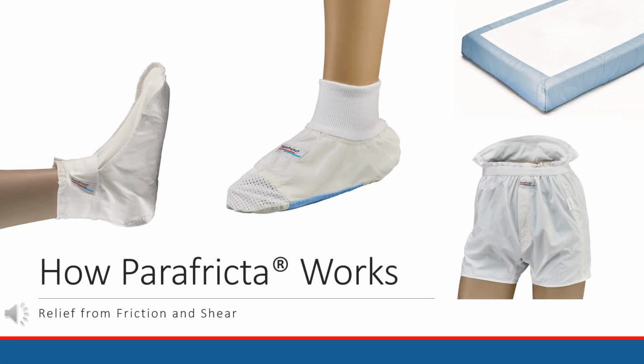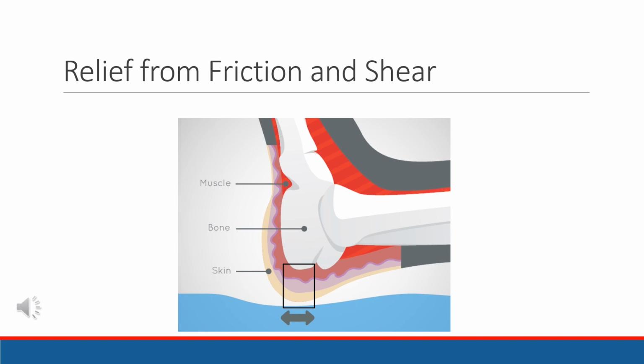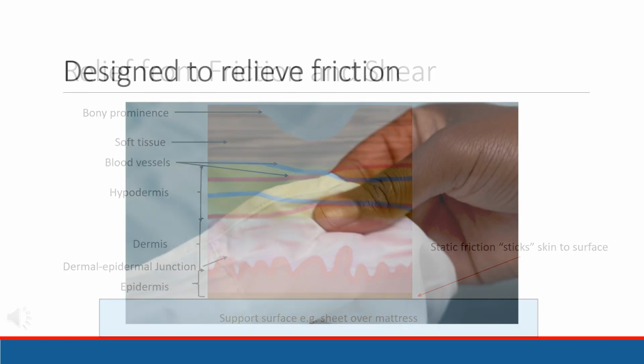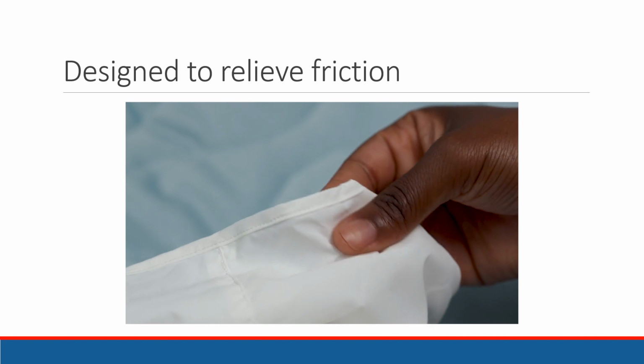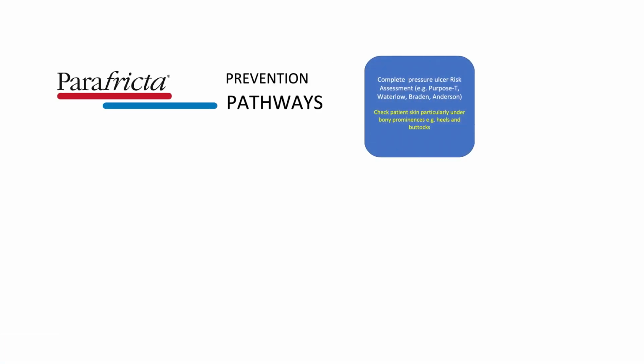Of course, many people understandably think that the primary cause of pressure ulcers is pressure or compression. We now know that in situations where people are moving on their buttocks or sliding because of the effect of gravity, the friction and the associated shear element may be as big a contributor to the breakdown of tissue and the eventual formation of a pressure ulcer. The ideal time to address pressure ulcer formation when friction and shear is involved is before it starts.